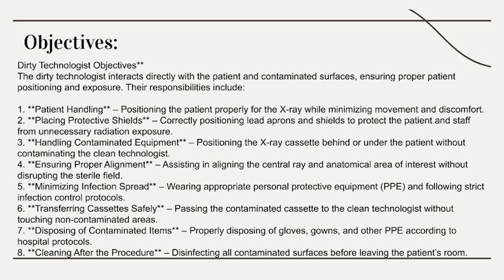Handling contaminated equipment, positioning the X-ray cassette behind or under the patient without contaminating the clean technologist. Ensuring proper alignment, assisting in aligning the central ray and anatomical area of interest without disrupting the sterile field. Minimizing infection spread, wearing appropriate personal protective equipment and following strict infection control protocols. Transferring cassettes safely, passing the contaminated cassette to the clean technologist without touching non-contaminated areas.